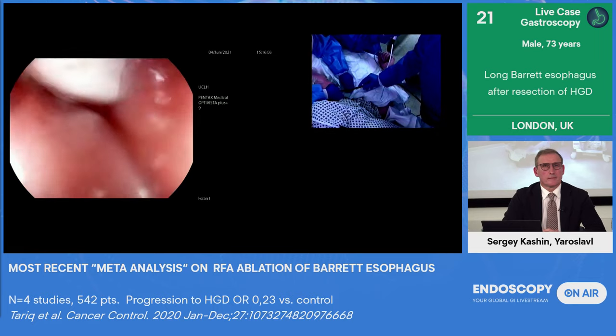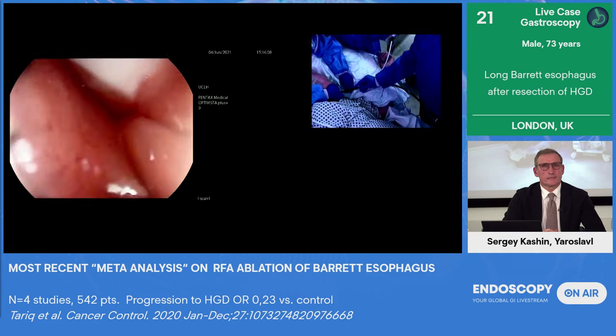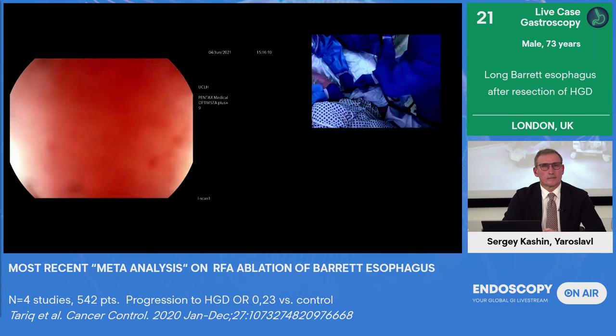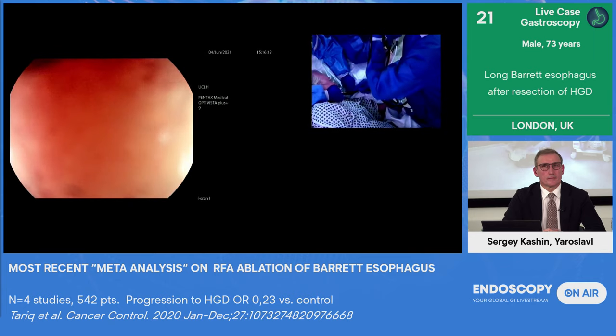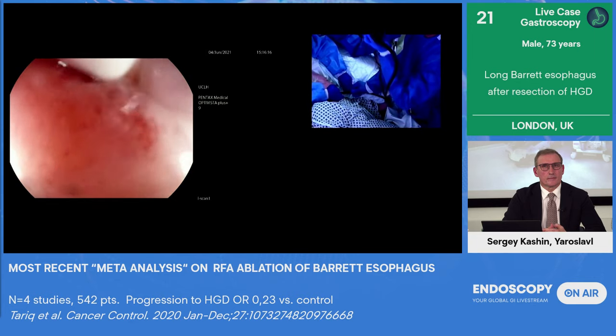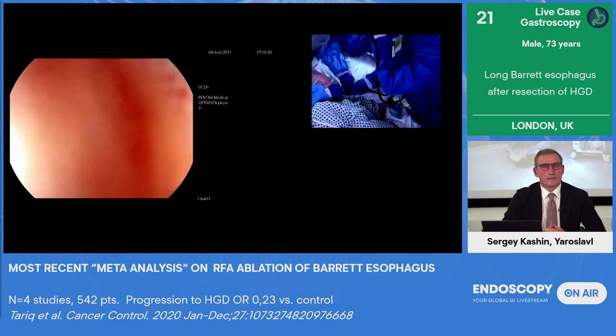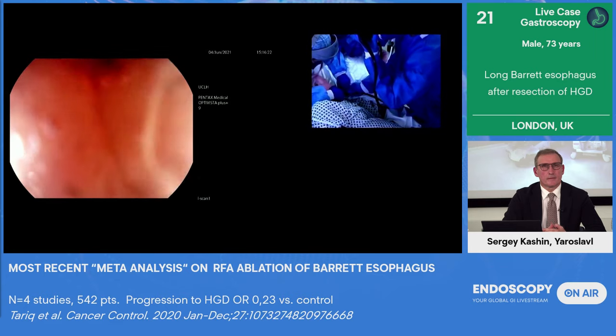There we go. So easy does it. There you go. And so Vinay's just going to very gently squeeze past the catheter into the cervical esophagus. Okay. Bit of spasm. Yeah, no, it's tricky. Okay, well done. Nicely done, Vinay.